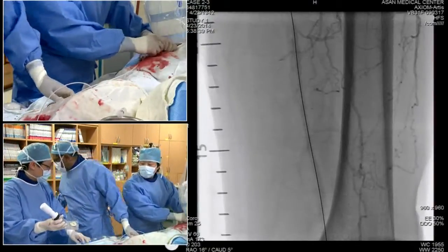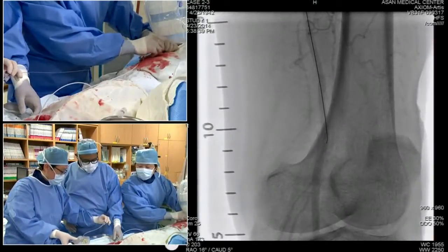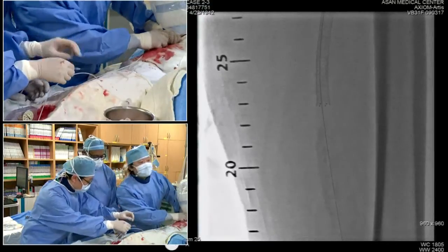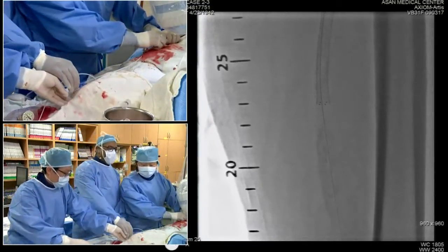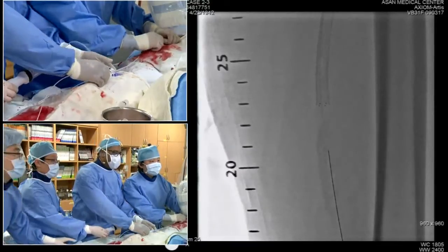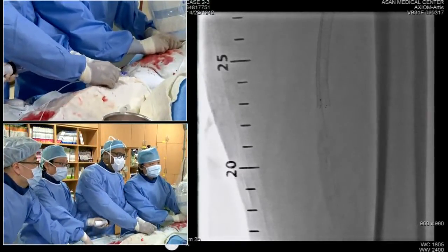So what we're going to have to do here... Wire. Yeah, wire. One second. The wire is short now. Did it come out? It didn't come out. Keep going. Okay. Oh, yeah, I can see the tip of the wire. Okay. Pull back the wire. Okay. Show us the distal wire, please. Thankfully, they were able to get the wire, making sure we don't come back out of it, without giving up the CTO.